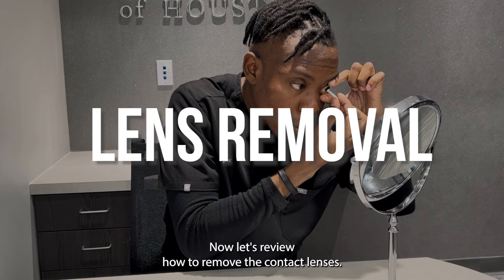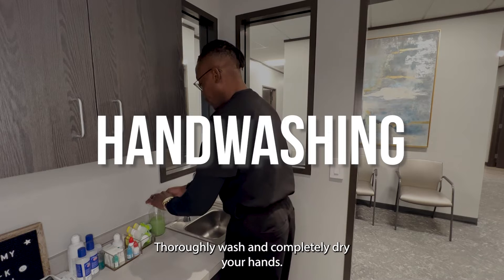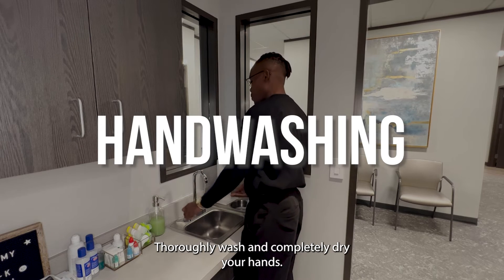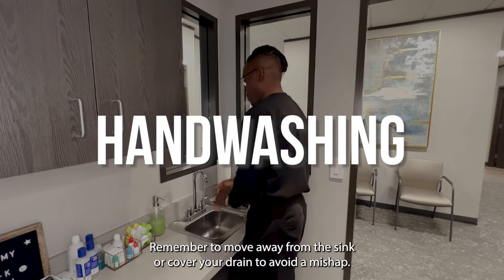Now let's review how to remove the contact lenses. To begin, follow the first steps for insertion: thoroughly wash and completely dry your hands. Remember to move away from the sink or cover your drain to avoid a mishap.